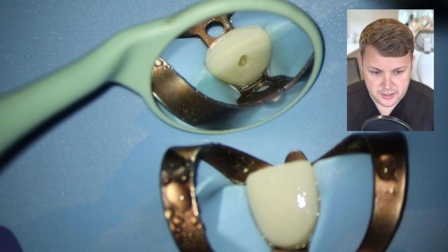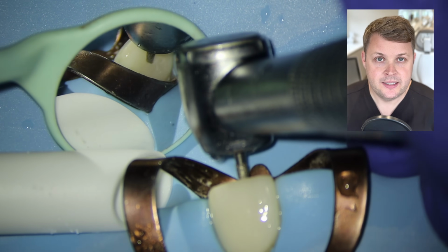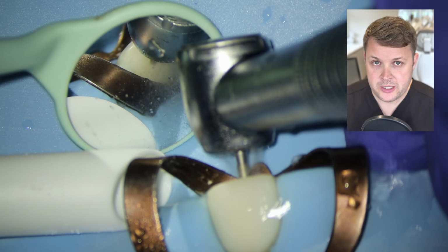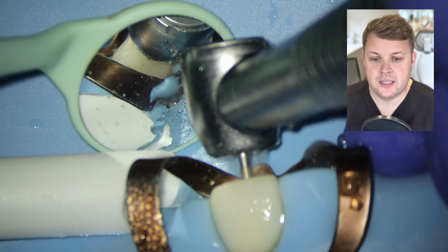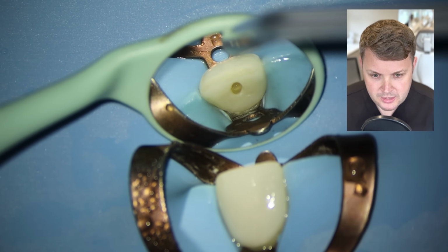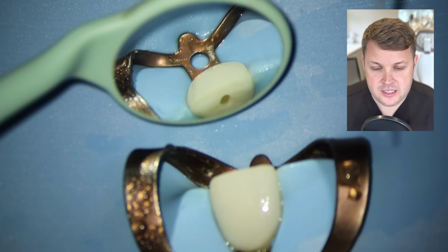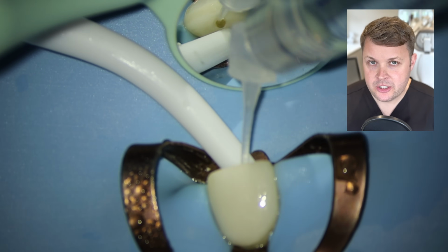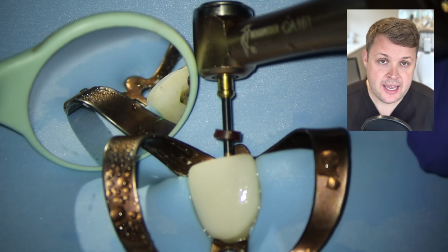So we know we're in the correct orientation, and then I am going to get my fast handpiece again with that torpedo shaped burr. I'm going to drill down, and then I feel for that characteristic drop into the pulp chamber. So I'm going to have a little look, but I can't really see any obvious access. So I'm going to do a little bit of irrigant, and I'm going to use an orifice opener.